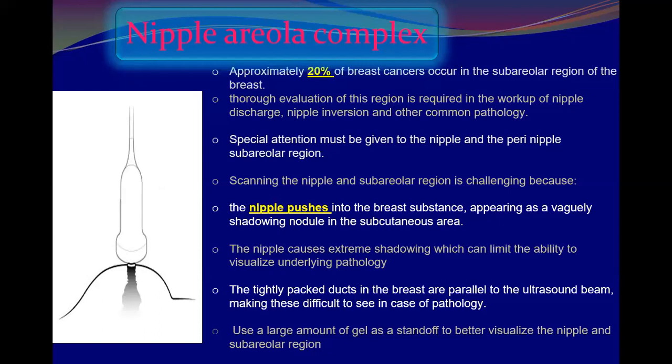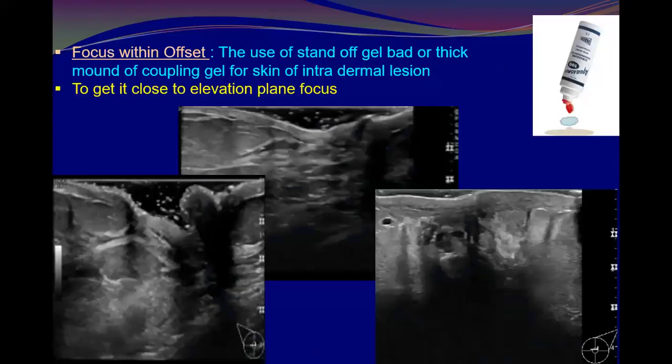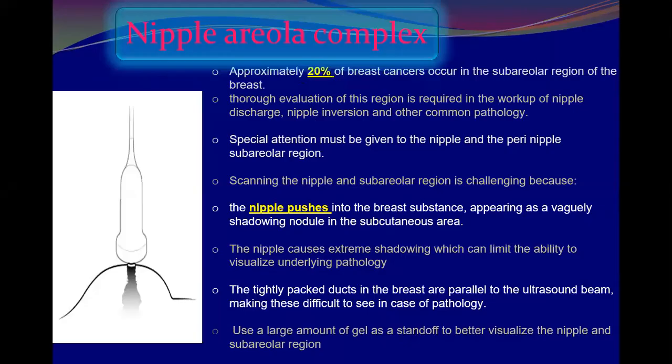We mentioned that one of the important techniques to visualize the nipple and subareolar region is a standoff gel pad, or focus offset. This is one of the techniques importantly used for evaluation of the nipple areolar complex.